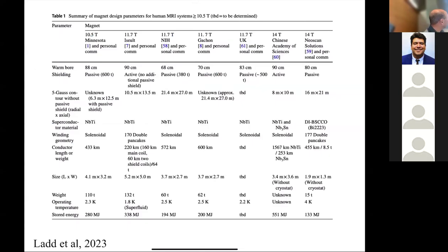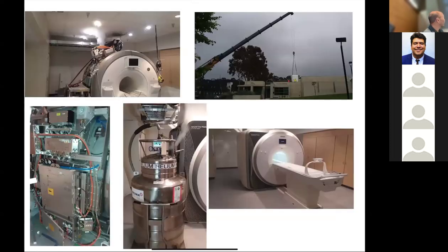This is just showing that there are a bunch of high field magnets being built at different places. And let's talk a little bit about what magnets look like. And so what you're seeing here is a magnet that is letting off liquid helium. Okay. So in general, that would be bad. Because basically that's what's called a quench. And it's basically you let off the liquid helium, the wire is going to heat up, you're going to lose your magnetic field. Okay. So there's only one time you should quench a magnet, when you want to bring the field down to move it.